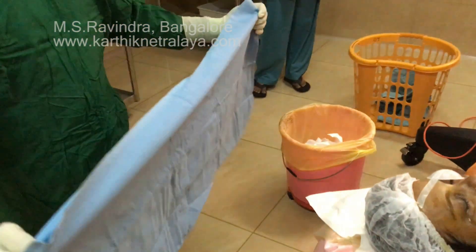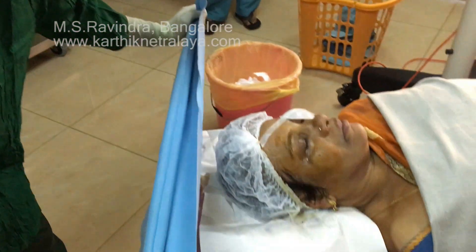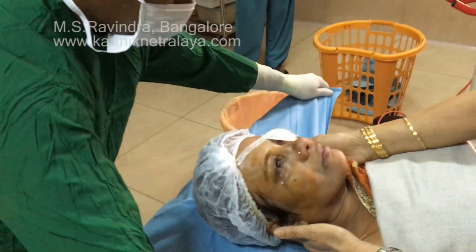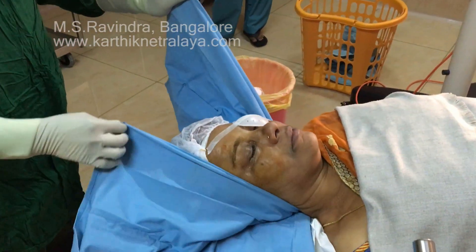The patient is ready for surgery of the right eye. The left eye is covered with an eye shield so that the drape doesn't touch the eye, and the patient will be able to keep both eyes open during surgery, which is done under topical anesthesia — no injected anesthesia is given.